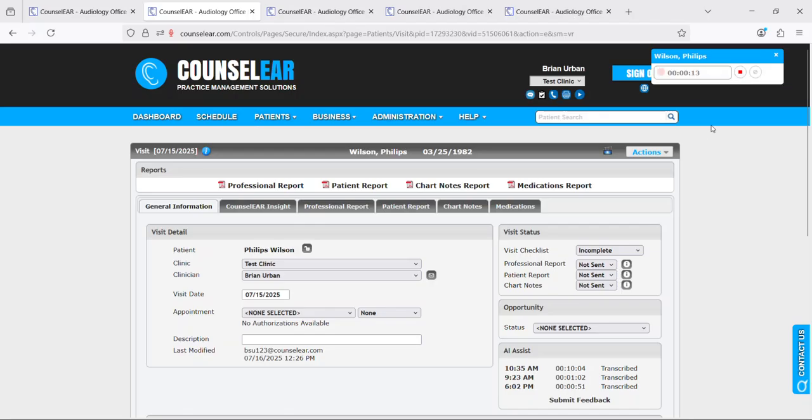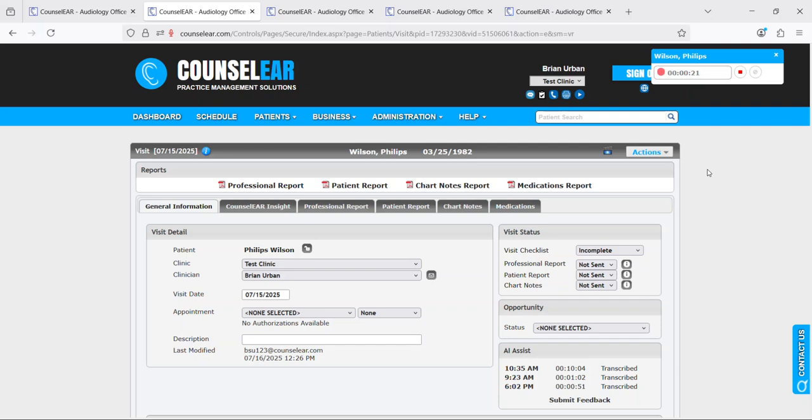But while this is running, it's going to listen to the conversation, or I should mention if you wish to dictate directly into this you can as well. So it does not have to be with a patient or their family. You could use this to dictate your thoughts, the case history, test results directly in.